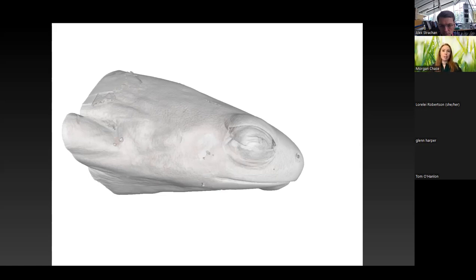Something else that we learned was that the osmium works really good for the small animals because it doesn't travel very far. It can't soak in more than like a millimeter or two. It wouldn't work for this because you would need a lot, it's expensive, and also quite hazardous. The iodine works a lot better for larger samples. So he would stain it, and different tissues will absorb the iodine differently, differentiating each of them visually for us.